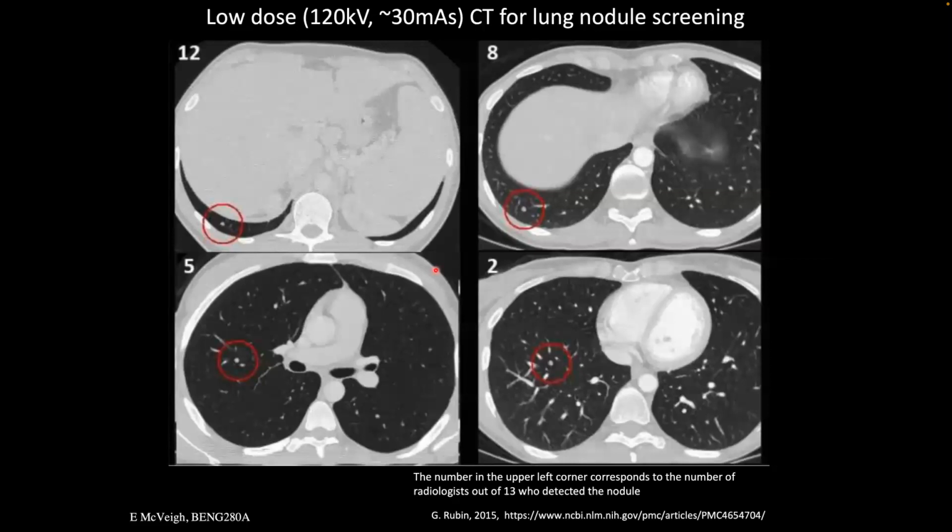Okay, so we can look at some advanced applications. We got 3 minutes. This is CT imaging of lung nodules. And it's been shown that this is a big application now, that if you're a smoker and you're above 50, you should have a CT scan to look for cancer in your lungs. If you take a whole bunch of smokers and do this, the total number of people that die in that pool actually goes down because you discover cancer early. If you do it in people who don't smoke, it doesn't really have much of an effect because you don't detect it very often, right?